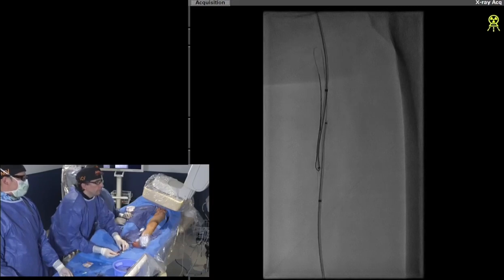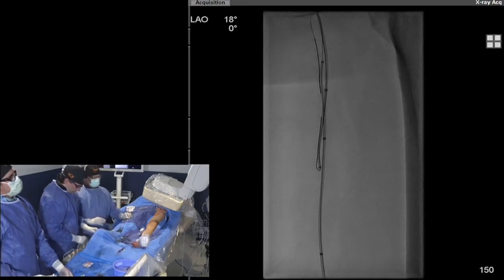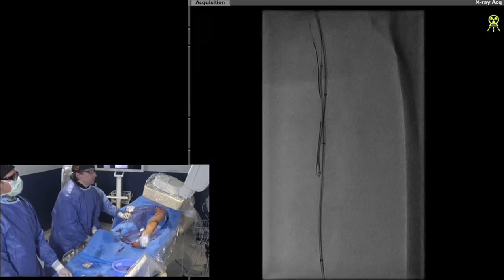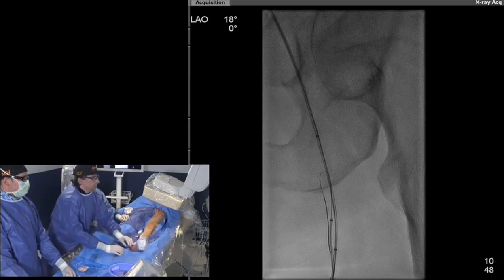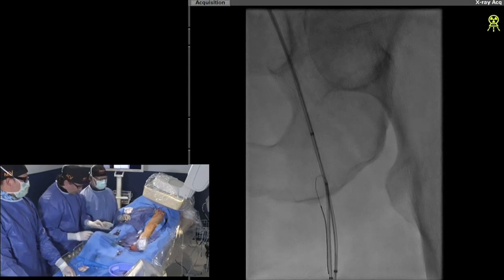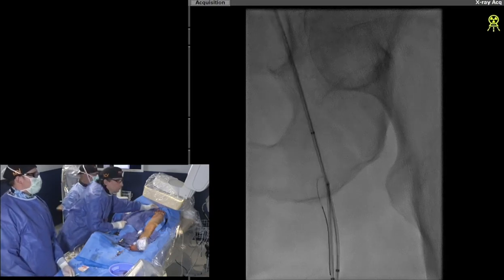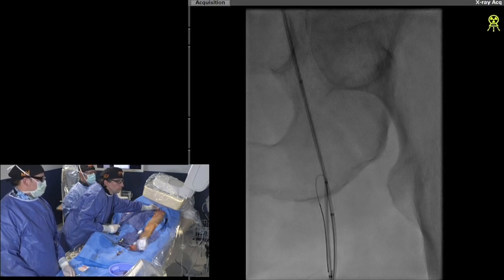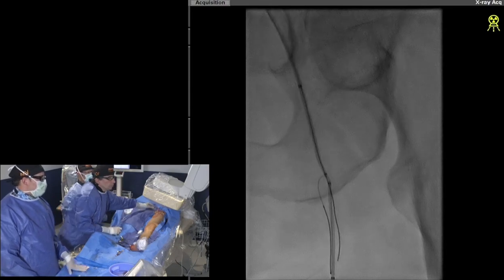I think I am crossing through. The concern is subintimal entry at the ostium. That is a salient point — people think that going antegrade you have the profunda protected, but you have to enter very close to the profunda so that plaque shifts medially and doesn't obstruct the profunda. Notice how the catheter from above is close to the profunda — we need the same thing from below, so when we go to treat we don't spill anything into the profunda.